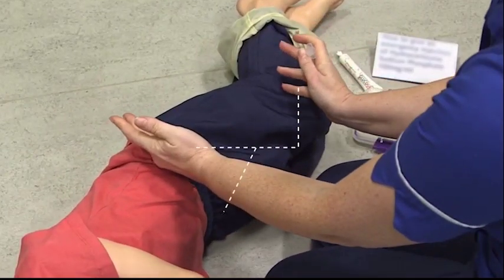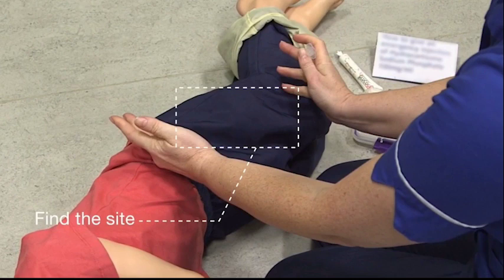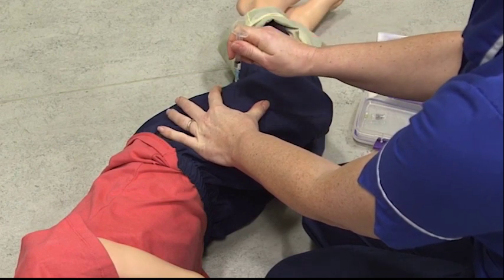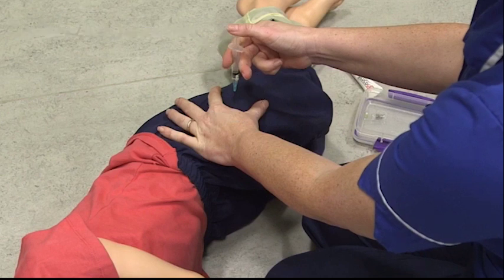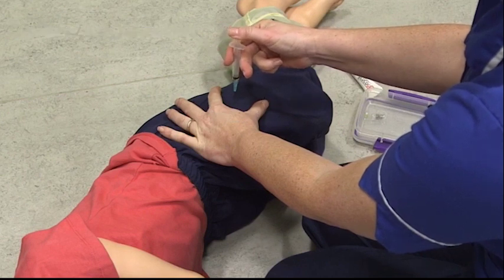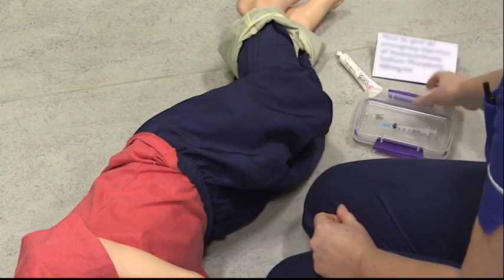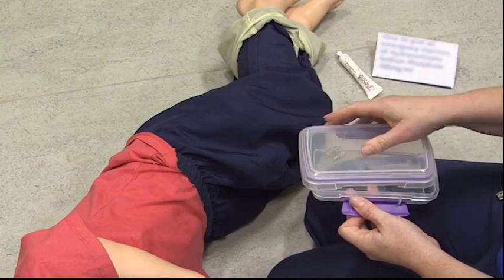Next we need to locate where we're going to give the injection. You're going to landmark from the hip and the knee into thirds and go along roughly where the seam of the trousers would be. You're going to hold the leg — you don't need to squeeze — and put the needle in at a 90 degree angle, then put your thumb over the plunger and push the solution in. Take it out, drop everything into the box, clip the box up and call 999.